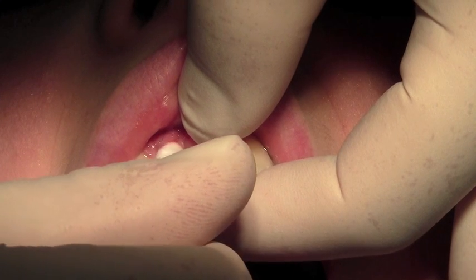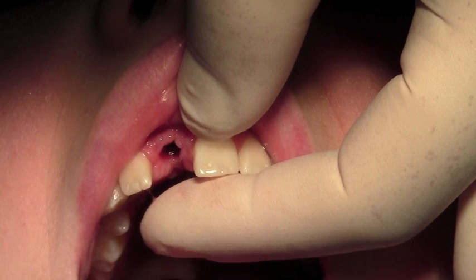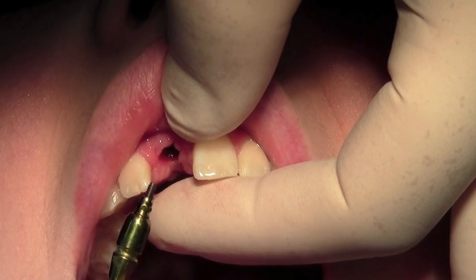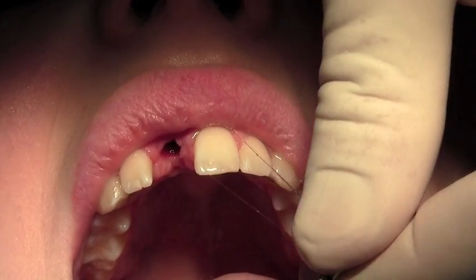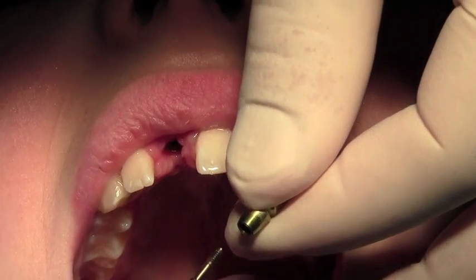You sometimes get a little bit of bleeding from the gum — nothing much. This is the 3.8mm impression post, mounted already on the 1.22mm driver, and there's the screw inside there.